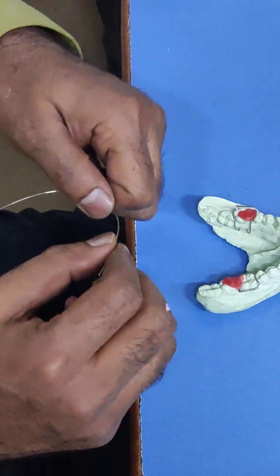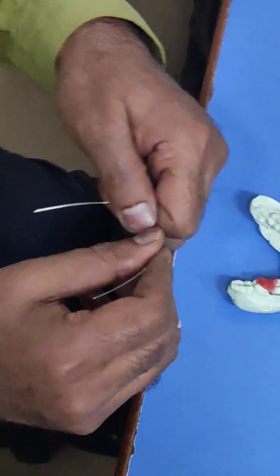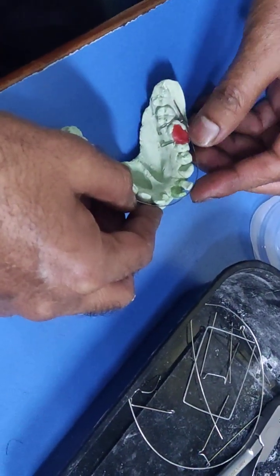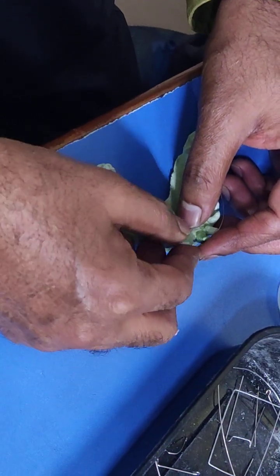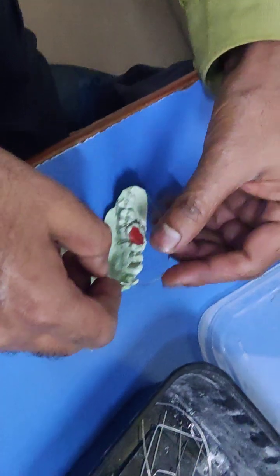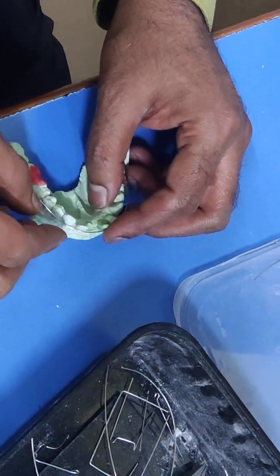First bend in the anterior region, then make it relatively narrower. Check it. Almost done. Now here it is more wide. That is okay.